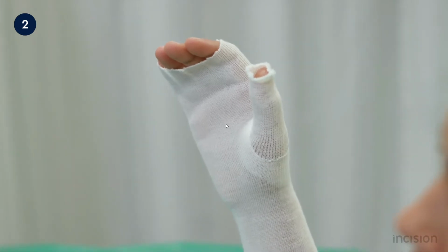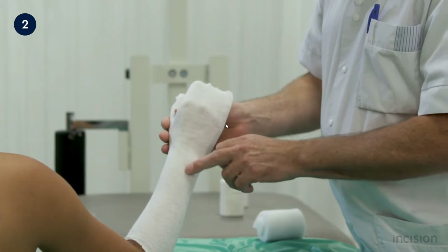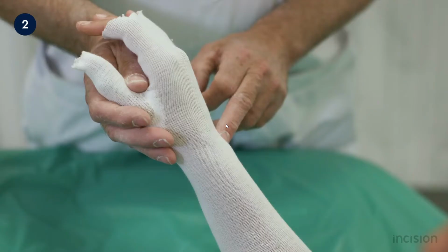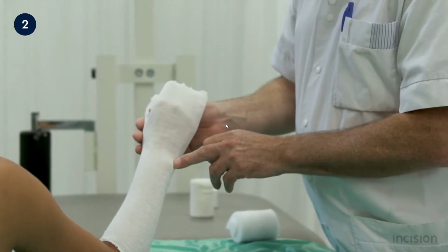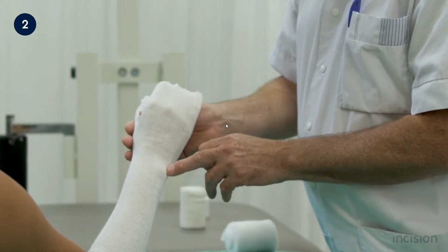Next, the padding needs to be applied. Care should be taken to apply extra padding over the ulnar prominence to avoid pressure complications. Too much padding should be avoided, as this may cause the splint to be too loose and be able to move over the arm, which may lead to scratches or blisters.